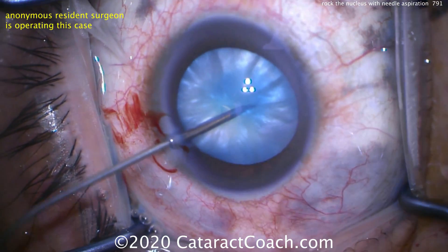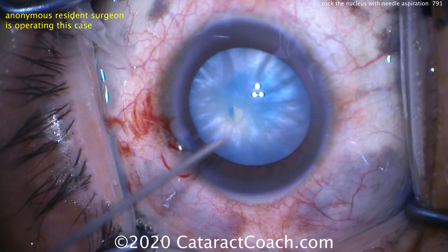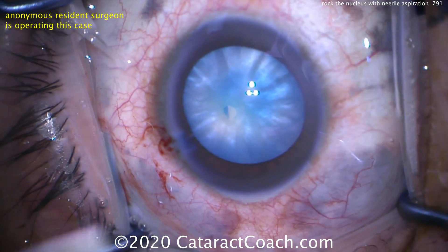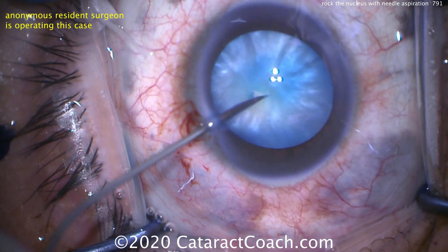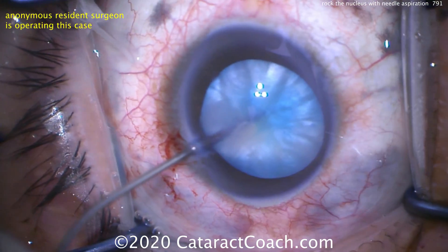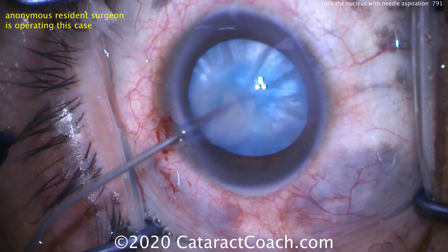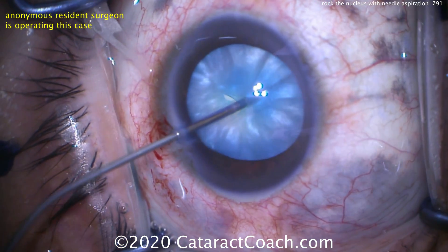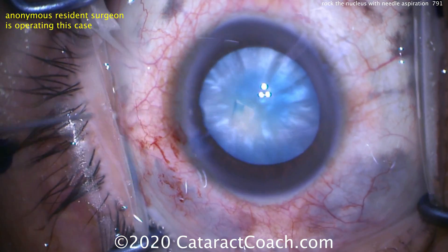We aspirated some of it, but that's just the anterior liquefied cortex. There's more behind the lens nucleus. To access that, we go back inside the eye, go in the opening we've made, and rock the nucleus back and forth to release more of that milky fluid, then re-aspirate. This has now really and completely depressurized the capsular bag, and we can proceed with the rest of the case relatively normally. We've really minimized that risk of an Argentinian flag sign.